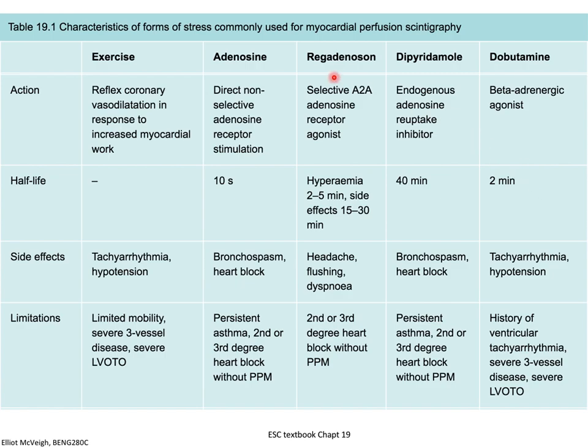So stress testing is a huge part of cardiology, and that's probably something all of you have seen depicted in a movie or know a relative or somebody who's done an EKG stress test, where they strap EKG leads on you and they make you walk on a treadmill, right? And you walk on this treadmill and then your heart rate goes up to a specific rate, and then if they can't get you going, they'll tilt the treadmill so that you're walking uphill for a while and get your heart rate even higher. And they look for EKG abnormalities. That's called a stress test.